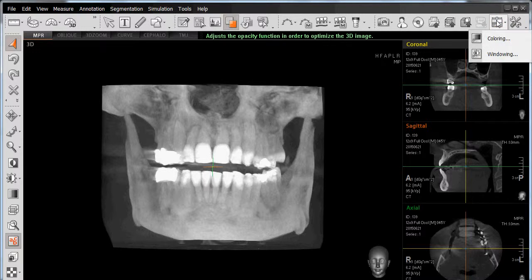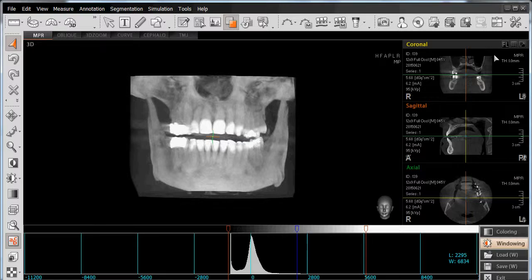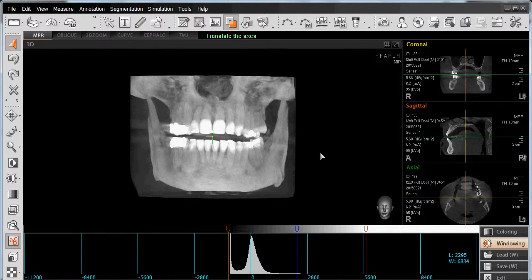Simply left-click on Fine-Tuning, and then left-click on Windowing. This will then open a scale at the bottom of our window, and there are two variables that we can control.